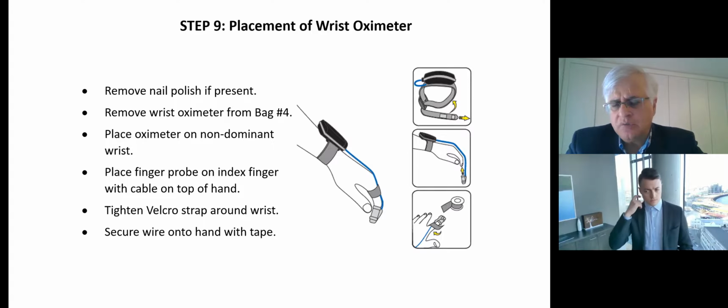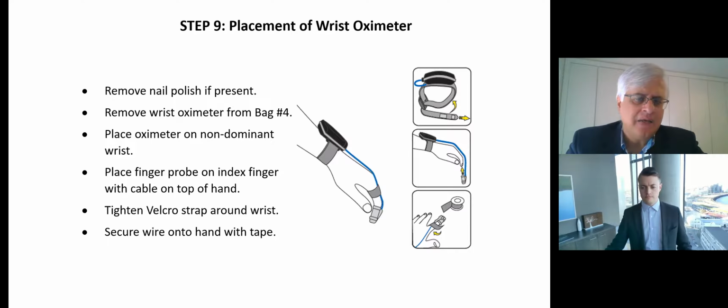The monitor, I should note, is operated by a AA battery. When we started the study, we were using rechargeable batteries, but since then, we've actually abandoned that approach. While it was very efficient, we abandoned that approach and now just use an isolated AA battery.